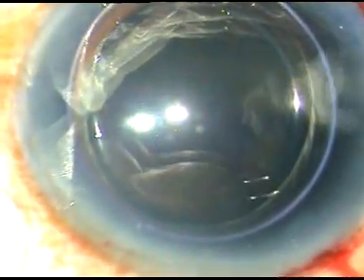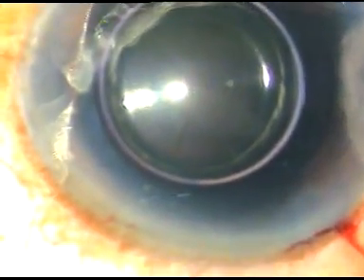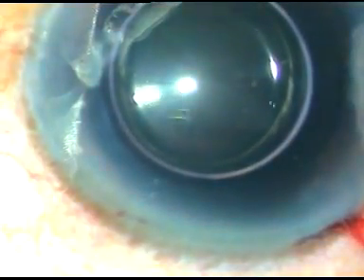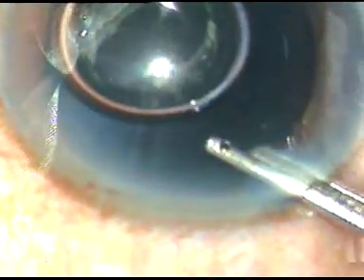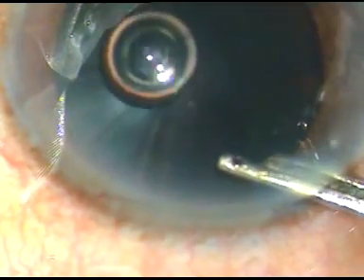Now, this is a little bit of adrenaline. The pupil has dilated well but if I can get a little more dilation it will be helpful. Now the dye is washed out of the anterior chamber using BSS.